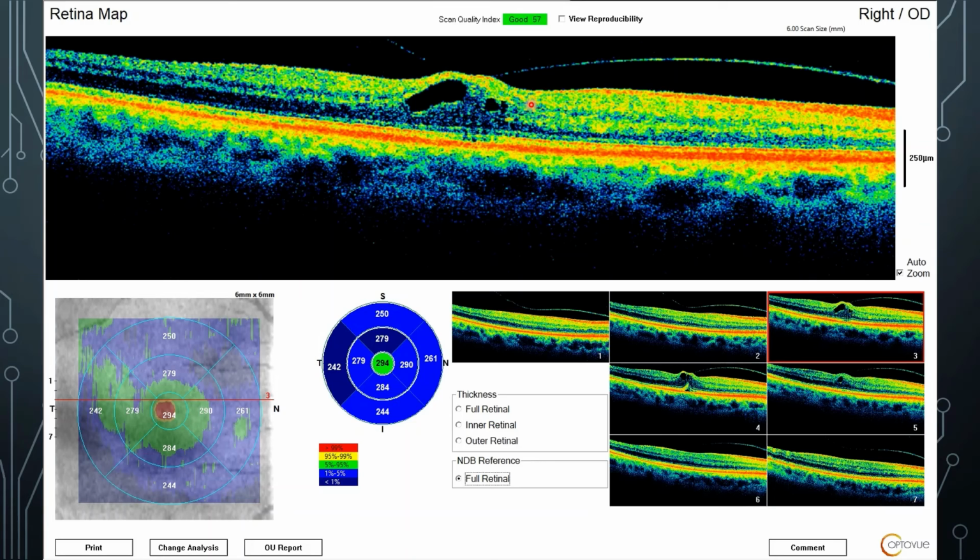And at some point, if that keeps pulling and won't release, it could form a through and through hole in the retina, right in the dead center of the vision, a macular hole. So there's ways that this tension can be released if we need to get that patient in to have that done. So this is how we monitor it, is with this OCT tool.